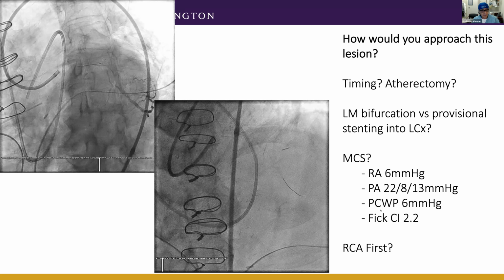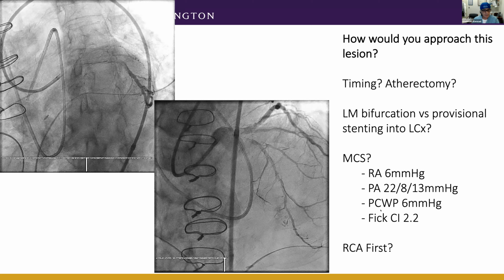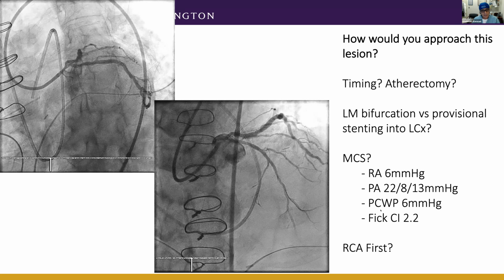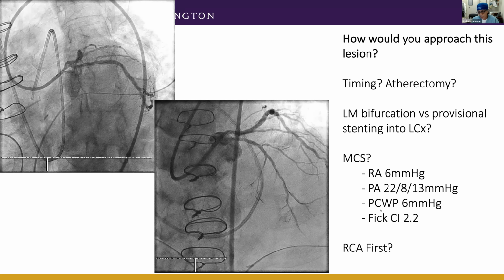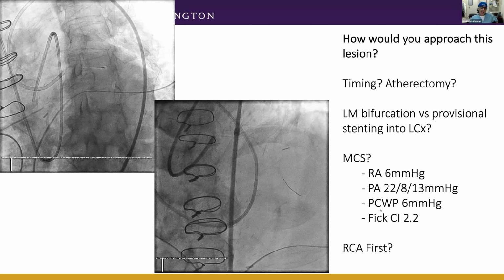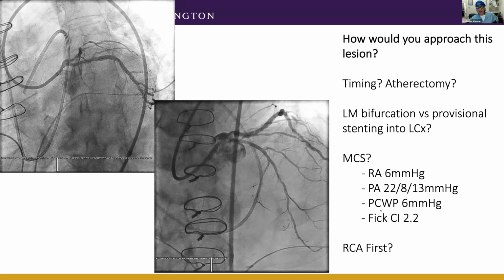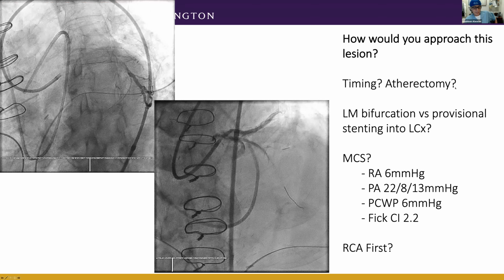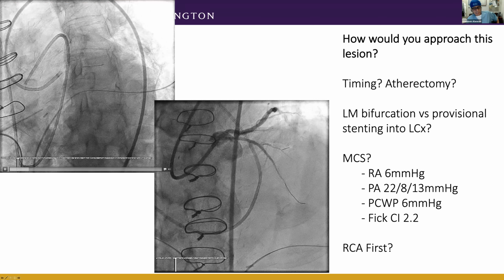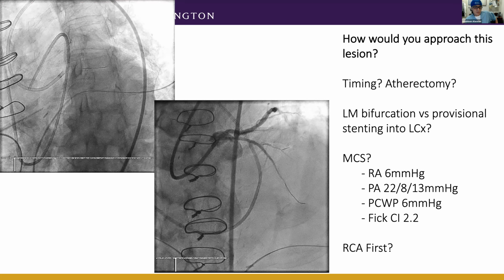So I can tell, you guys started with a 45 centimeter bright tip sheath in there. Do you see the bright tip? 45 centimeter sheath, and this is an 8 French guide, Catherine? It is an 8 French guide, that's right. Of course. The problem with trying to minimize your guide in complex cases like this is it's going to be long and a lot of torture, not to the patient only, but also to the operator, because you're going to have to do kissing stenting and use high pressure balloons. These are big vessels, so you'll need big stents and big kissing balloons. Trying to get those through 6 French or even 7 French is sometimes really difficult.